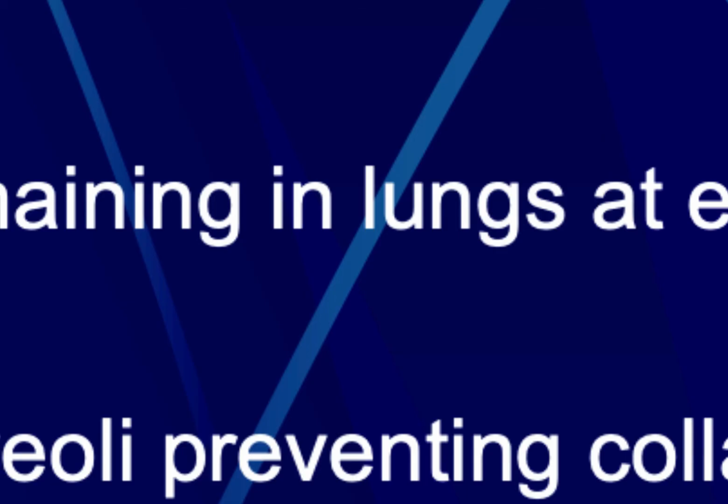The goal of CPAP is to increase that functional residual capacity, which is basically the volume of gas, of air, that is left in the lungs, in order to help stent the alveoli open, so that when we take that next breath in, those alveoli are already stent open, those capillaries that are surrounding the alveoli are already stretched out, and it makes it easier for that oxygen molecule to cross into our system and offload the CO2.